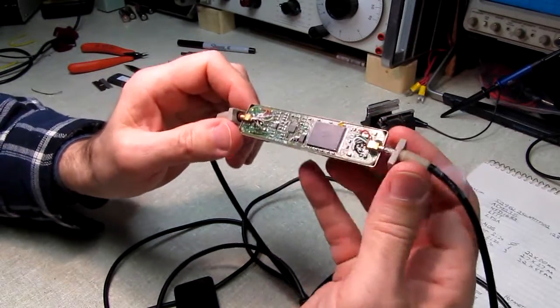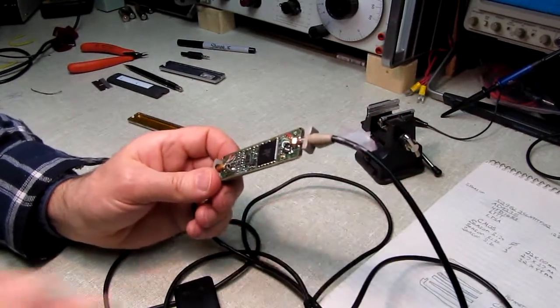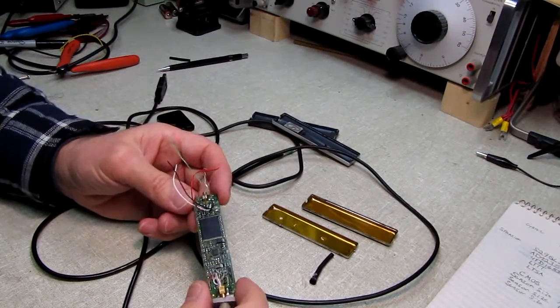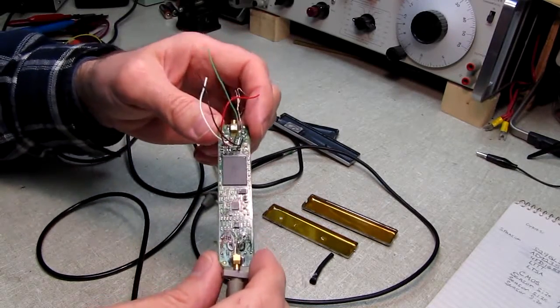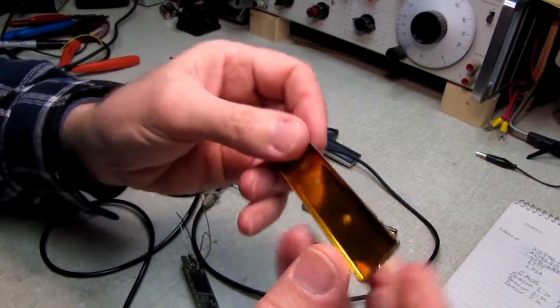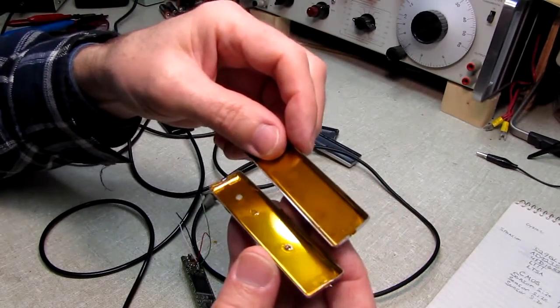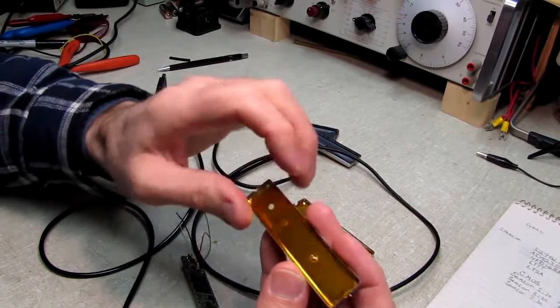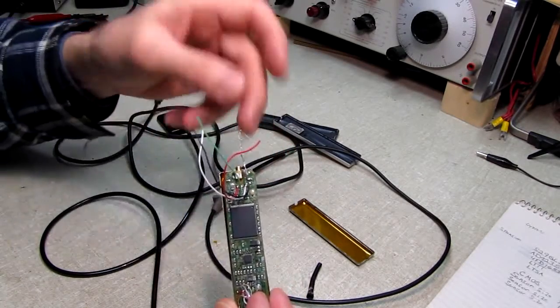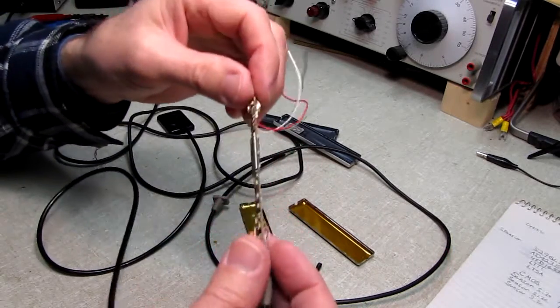So, again, through the magic of digital editing here, I'm going to see if we can get this thing apart, and we'll come back. Well, through the magic of time-lapse, we've progressed a little bit here, and I was wrong. This board was not glued in. What appeared to be adhesive through these 2 back holes was some kind of conformal coating that's on the inside of both of these covers, evidently to keep anything from short-circuiting against the metal. And when I put the heat to this piece here to get the braid of the cable loose, it popped out, and there it is in my hands.